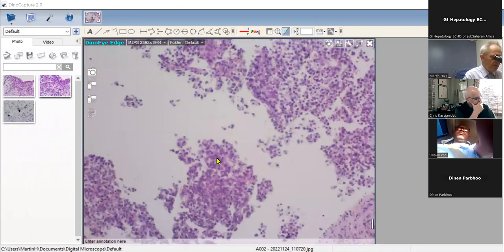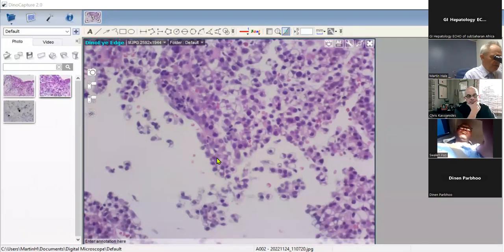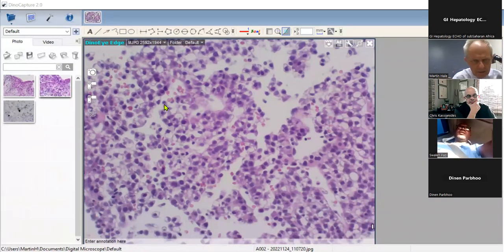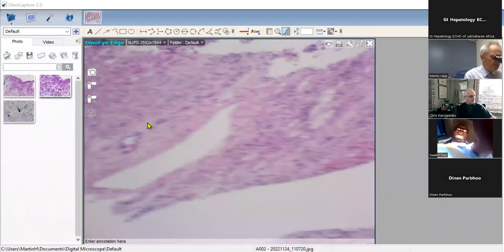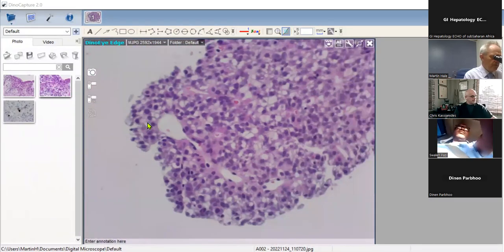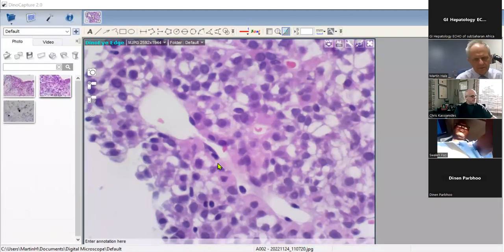I mentioned that when these biopsies fall apart, that tends to suggest that there's pathology. And if we look here, you can see that these spaces are not falling apart, that these, in fact, are sinusoidal-like regions. So there's one there, there's another one here. This is artifact, this is truly falling apart, but this is not. You can see there's some sort of continuity in the cells. And there again, that's a pretty good sinusoidal-like area. You can see that there. These are these prominent endothelial cells.